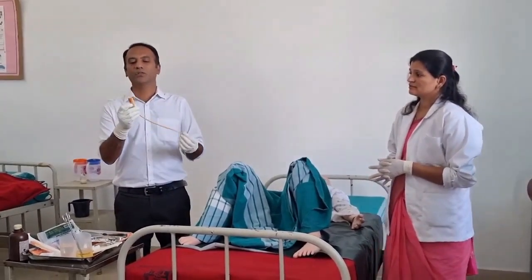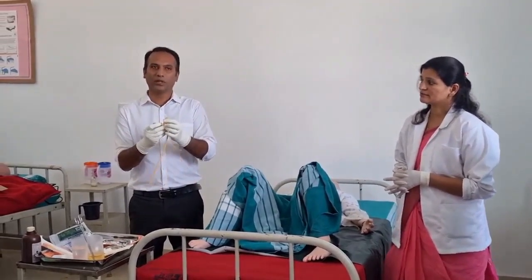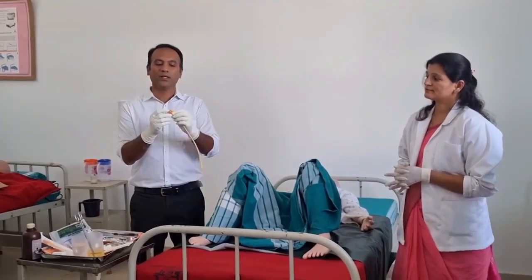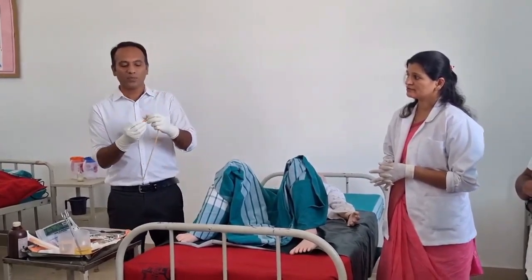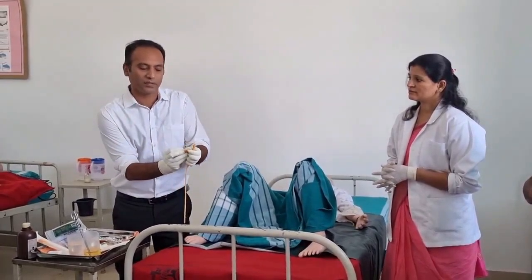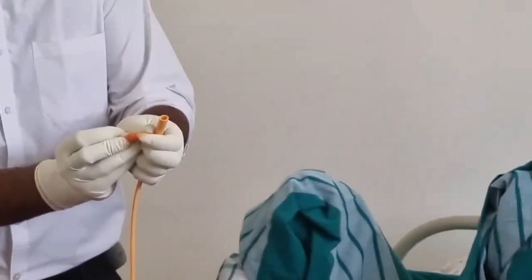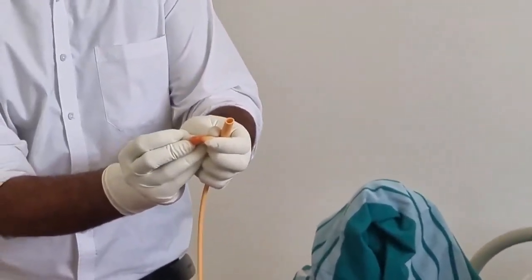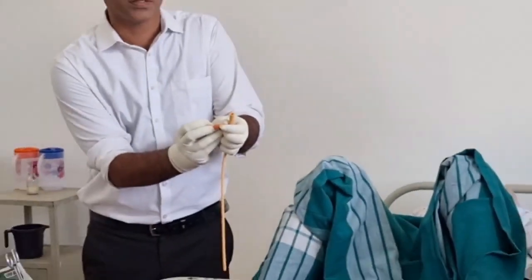Actually, it has two lumens. One is for draining the urine from the bladder, and the other is for inflating the balloon. If you observe closely, they have written the gauge, the size, 16 FR. 16 FR is the diameter, the French gauge.